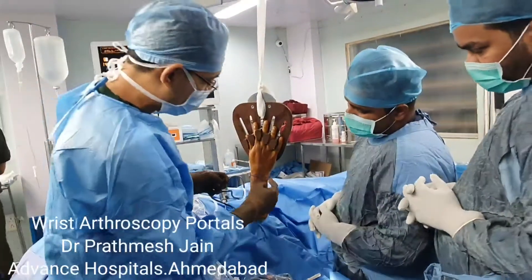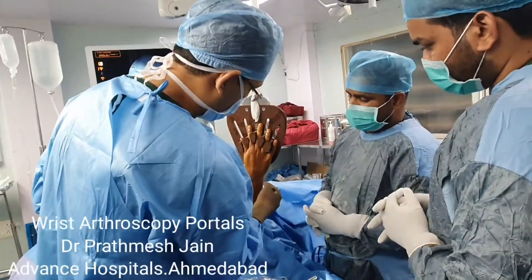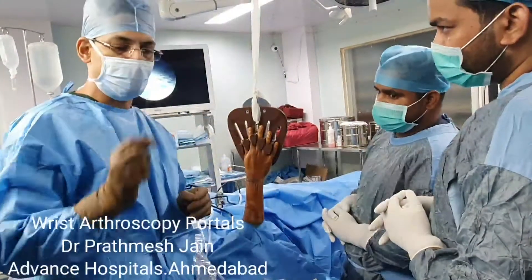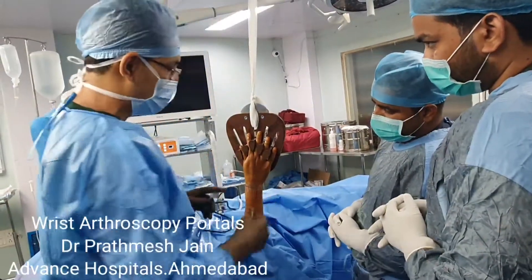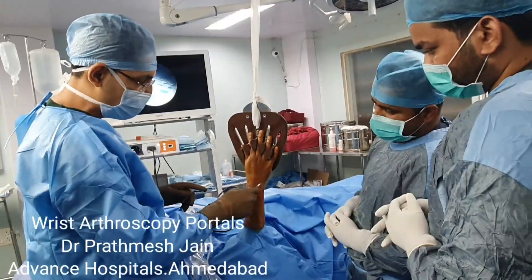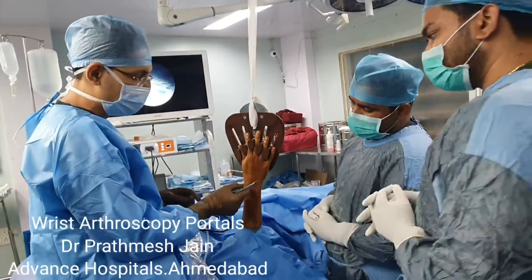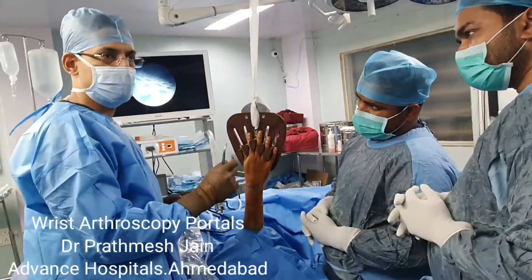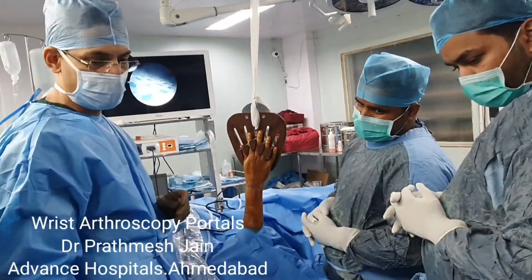That is very important. If there is a TFCC tear, you need to work in this particular area, and there will be some sensory nerves in this area as well. So whenever you make a portal, you just make a small nick and then dilate the skin with a mosquito artery forceps.